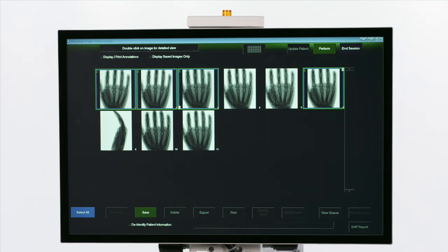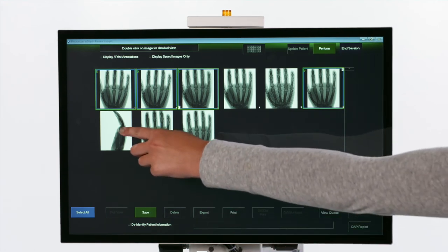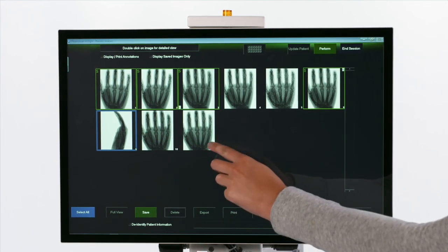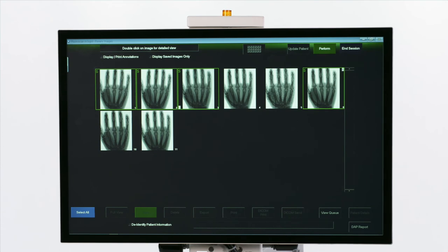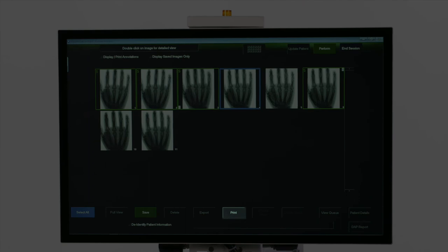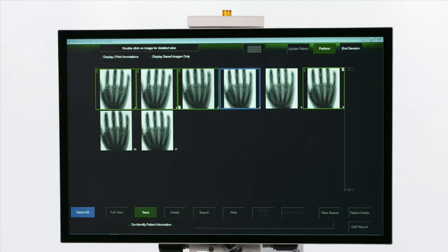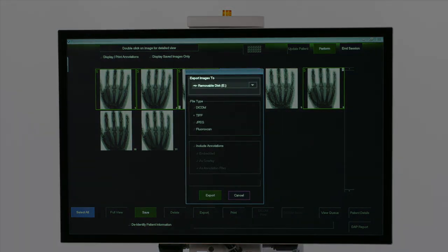To delete images, select the image and then simply click Delete. To print, select the image and click Print. To download images, insert an external drive and click Export, then click the appropriate device.